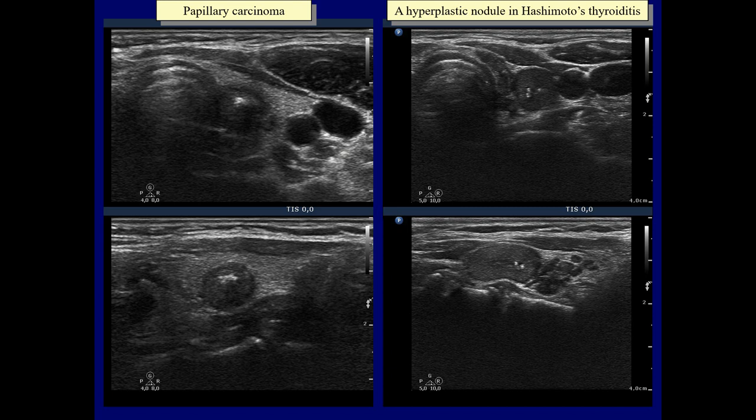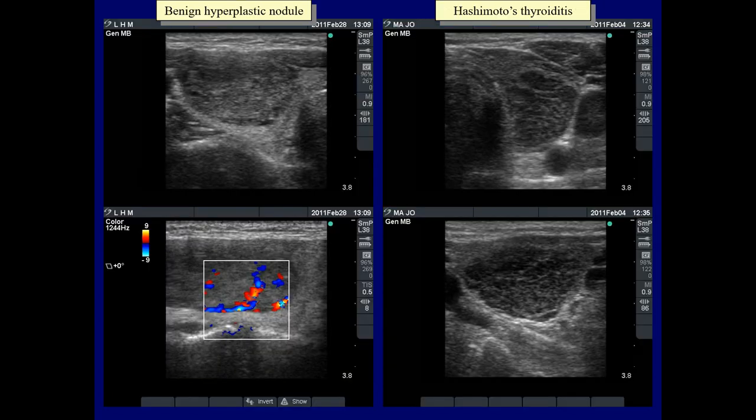In the event of thyroiditis, there are multiple small, more hypoechoic lesions in the lower half of the thyroid. Both cases present fibrosis, which is extensive in the case of thyroiditis. The sonographic appearance of thyroiditis mimics that of a large hypoechoic nodule. The small irregularities in the surface of the hypoechoic part and the presence of small hypoechoic areas within the extralesional part are those features which stand against the large lesion being a nodule in a pathological sense.